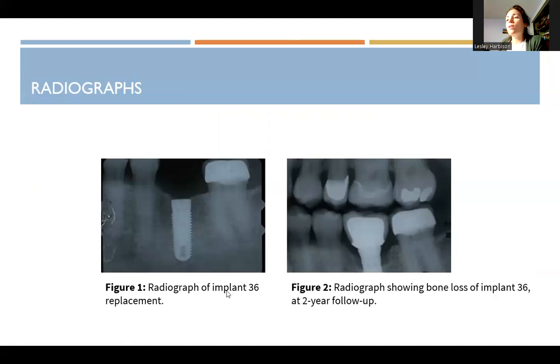This is a radiograph of an implant replacing tooth number 36 using a different numbering scale. The follow-up radiograph shows dramatic bone loss around the implant — you can see the threads exposed all the way down. This would catch your attention because something is significantly affecting that implant.